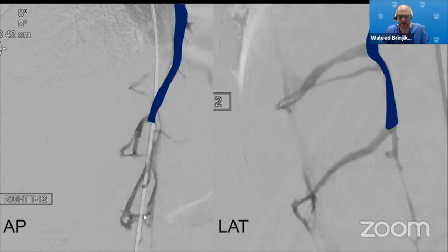Now, the CSF venous fistula occurs somewhere here, somewhere in the lateral epidural plexus foramen, or in this venous complex here. This is a venous network that surrounds the nerve root sleeve. This circle is surrounding the nerve root sleeve. What you can imagine is that the nerve root goes through this circle right here and right here. So when I do the embolization, I like to get this, and then a little bit of this, the paraspinal vein.